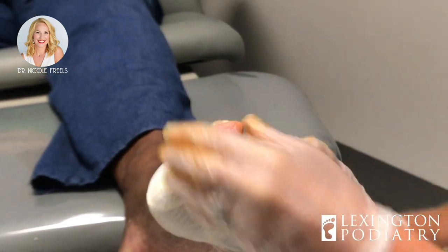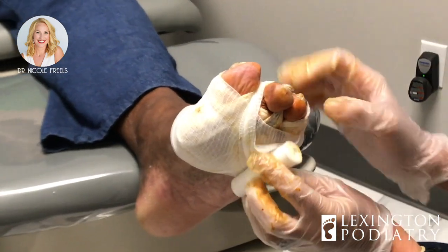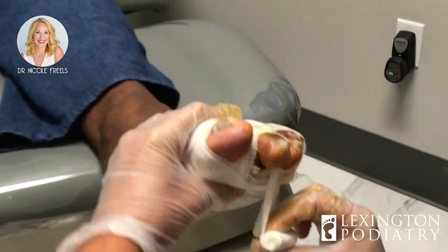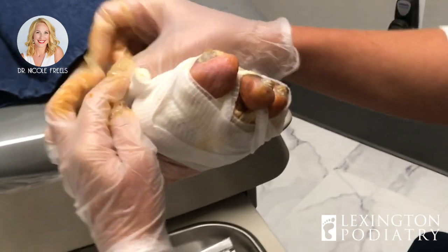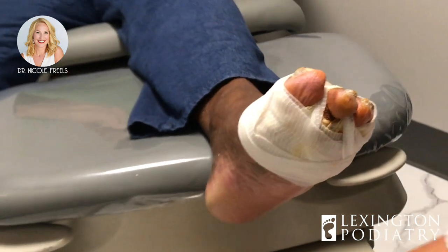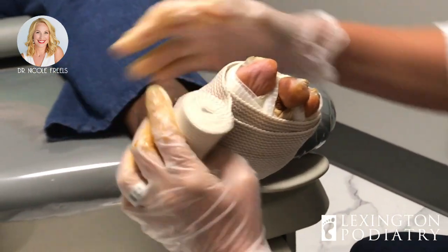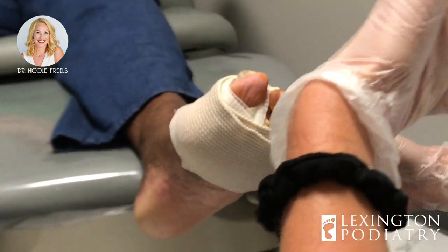If anybody has any questions or comments below on whether you're a good candidate, please let me know — I'm happy to comment. Ideally this gentleman will no longer suffer from his callus and will no longer be at risk for an ulcer to this toe. Now I've got our gauze on there — just putting a little ace bandage. This layer, if you feel it's too tight feel free to loosen it up, but reapply it. It's really important because it's giving us compression.